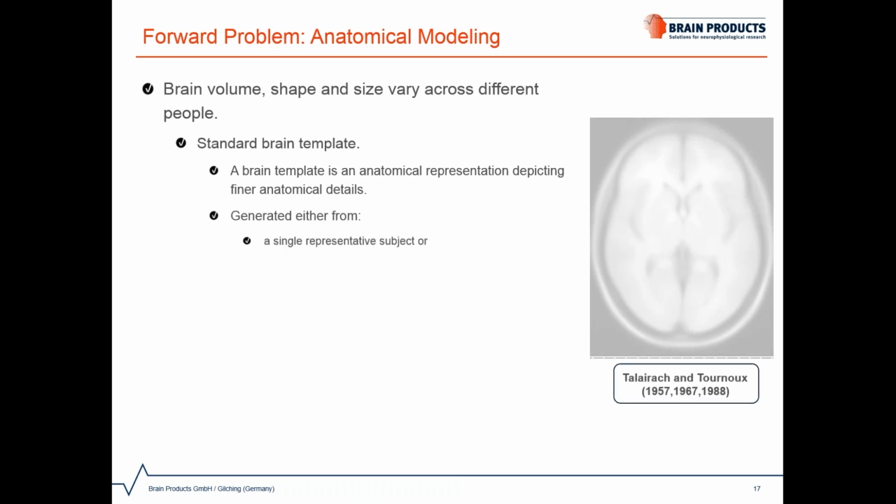Brain templates can be generated from a single representative subject, where Talairach and Tournoux constructed the brain atlas from a single post-mortem brain of a 60-year-old French woman.